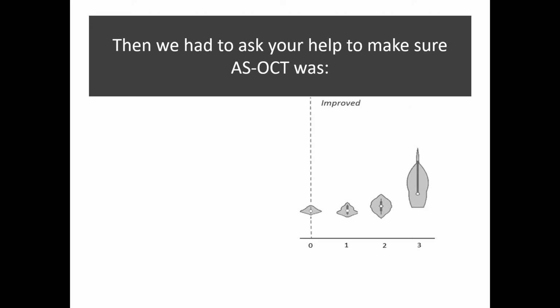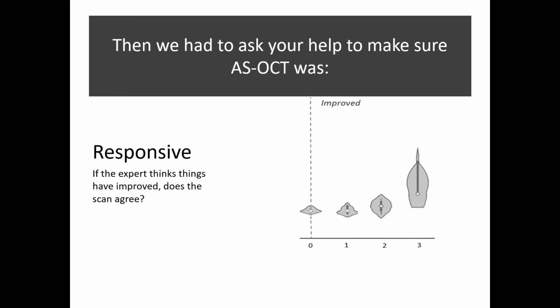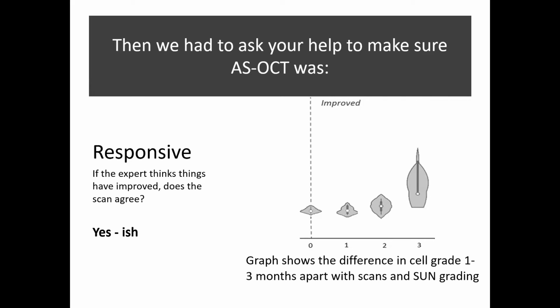The next question was, is it responsive? So if the expert thinks that your condition is improving, does the scan also show that? And we found again, yes, but with a bit of an ish. And this is one of the graphs we found from some of the results, showing that there was a correlation between the experts and the scan in the improvement of the condition.